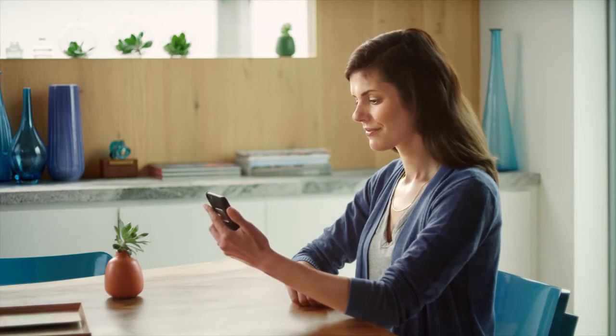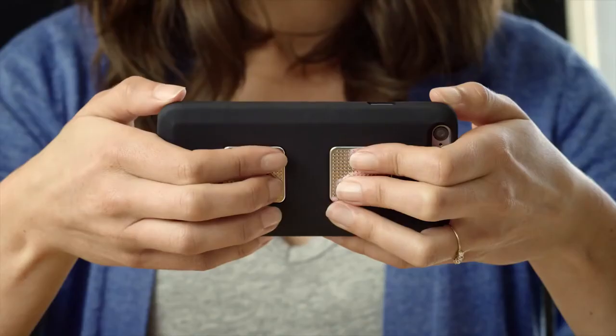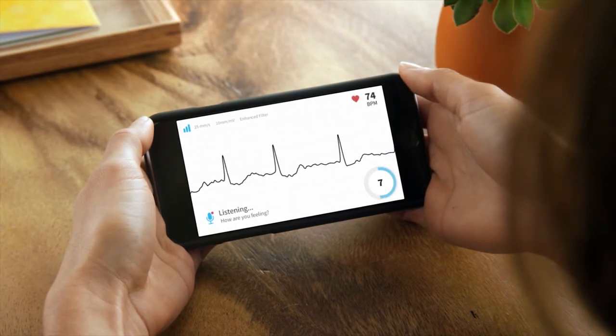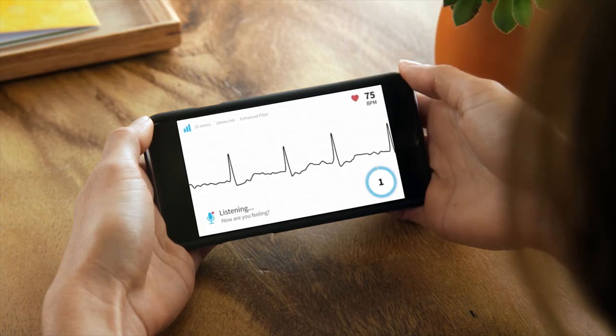Cardia is just as easy to use on your smartphone or tablet. Here's how Cardia Mobile works. Open the app and rest your fingers on the electrodes. A recording screen will appear — describe any symptoms you're experiencing in a voice memo. I've been drinking more coffee than usual, and I think I'm having palpitations.